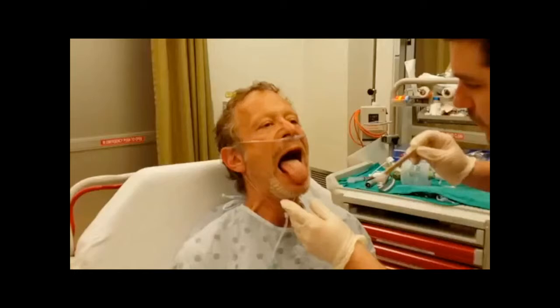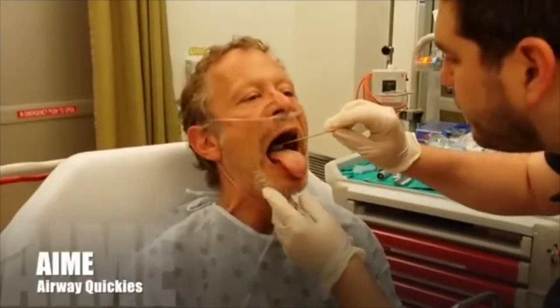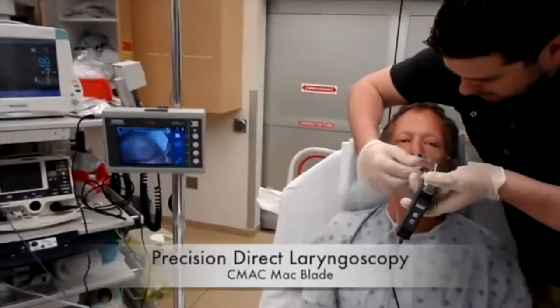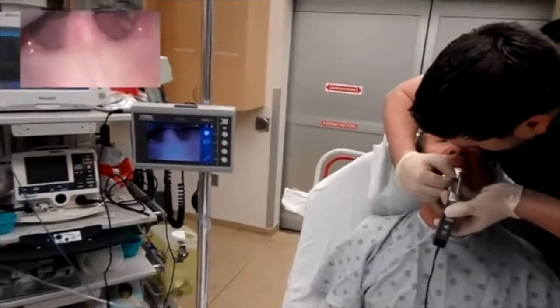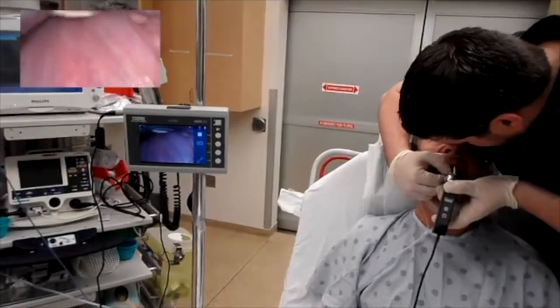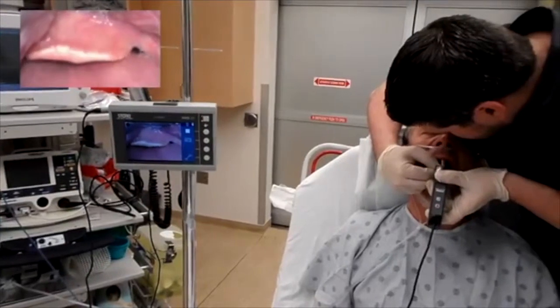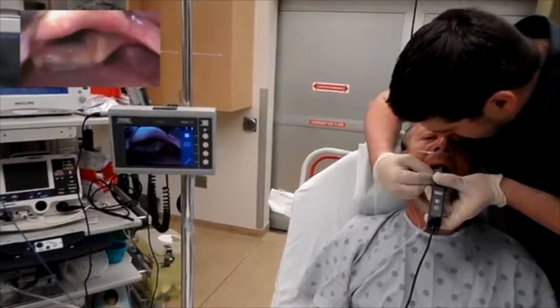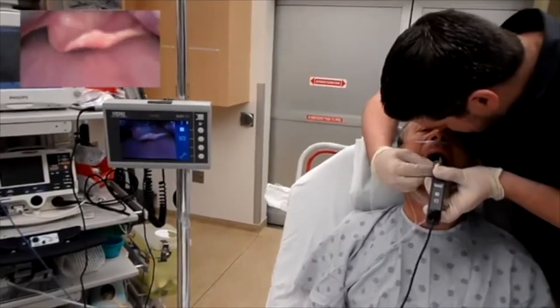This is off his YouTube site. Hopefully this will work. So this is the lignocaine lollipop stage of the local anaesthesia. Now this is what they describe as precision laryngoscopy. The patient is sat up, the intubator is over their left shoulder and stood on a stool, and he's attempting not to touch the tongue at all here. So although the patient's got topicalisation, he wants to limit the stimulation. He's using a standard C-MAC 4 blade at this stage.